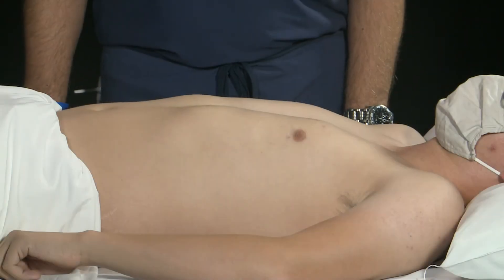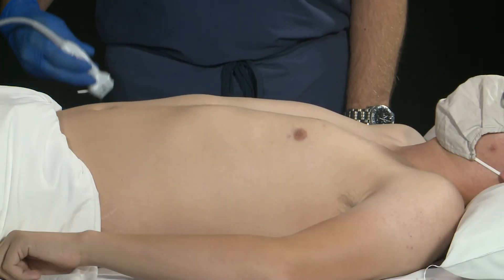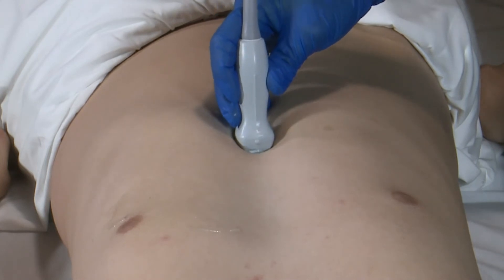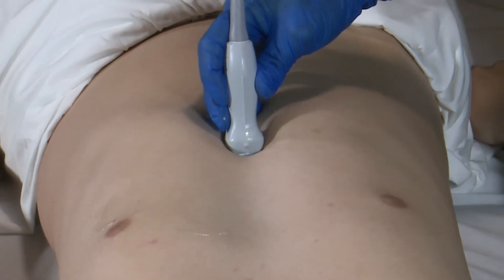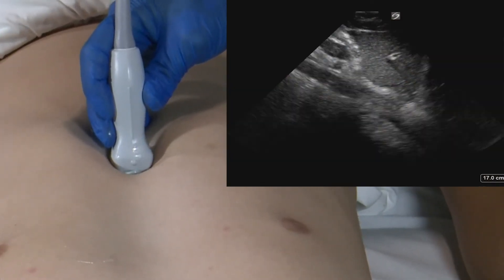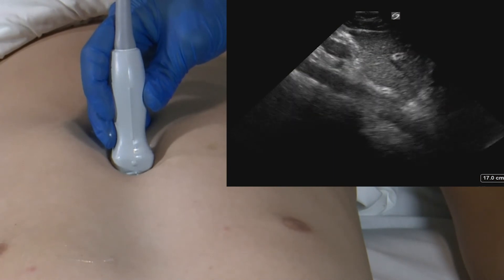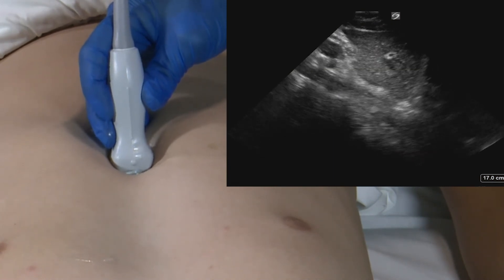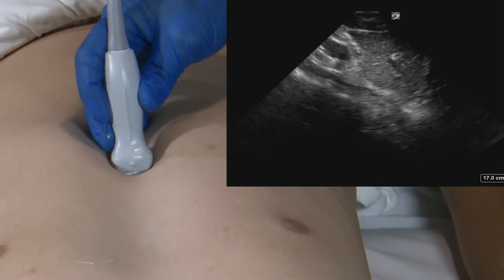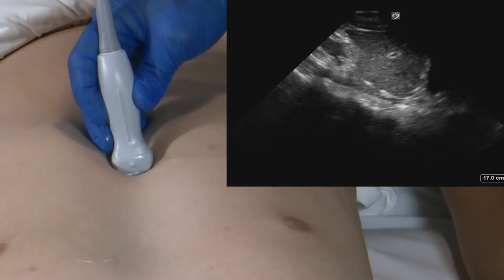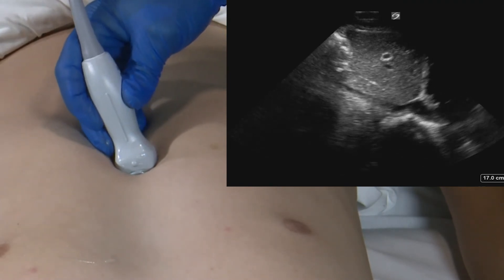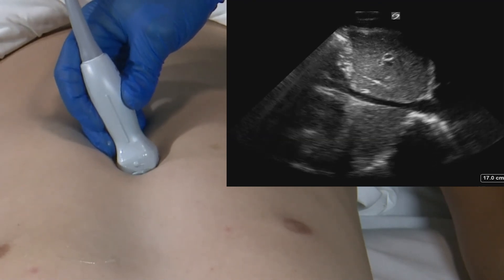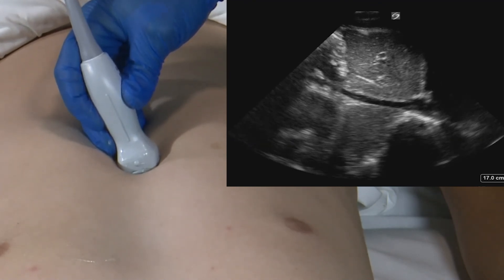To image the inferior vena cava, we're going to place the transducer immediately caudal to the xiphoid process. The marker dot is going to be directed towards the patient's head, and the probe is going to be in a sagittal orientation of the body. Once we have this view, we're going to slowly fan the transducer towards the patient's right until we're able to see the IVC as it's entering into the right atrium.